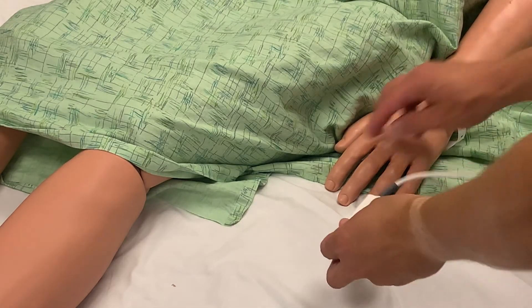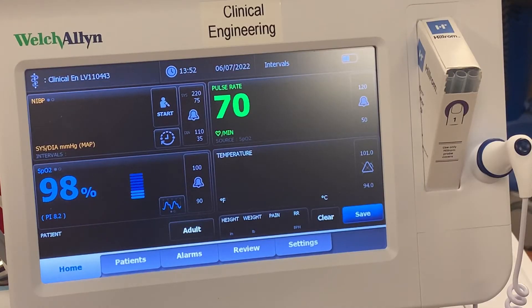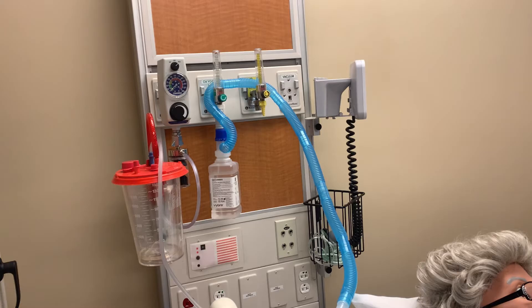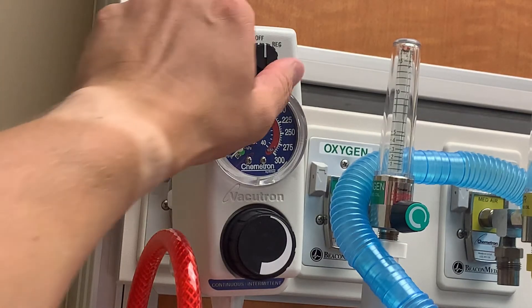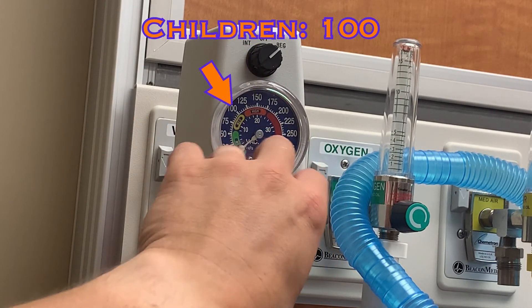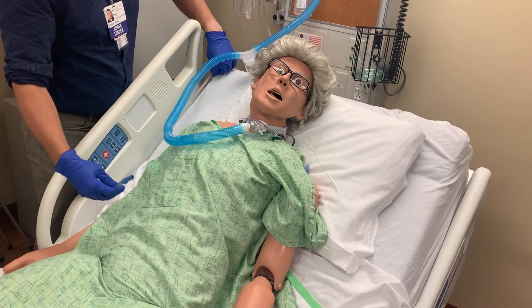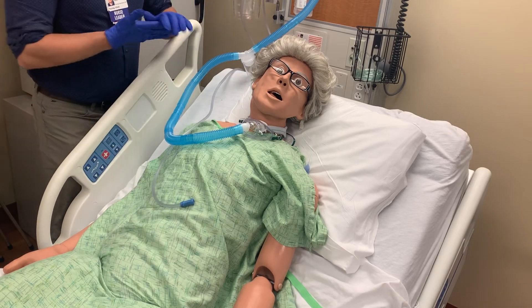Apply a pulse oximeter to the patient so you can monitor their oxygenation and heart rate during the procedure, as both can potentially decrease during suctioning. You will be using the wall suction to remove all secretions — ensure everything is set up appropriately. Then turn the suction to REG and increase the suction to 150 for adults or 100 for children. Take the suction tubing and drape it over the bed in a position that will be easily accessed when suctioning.